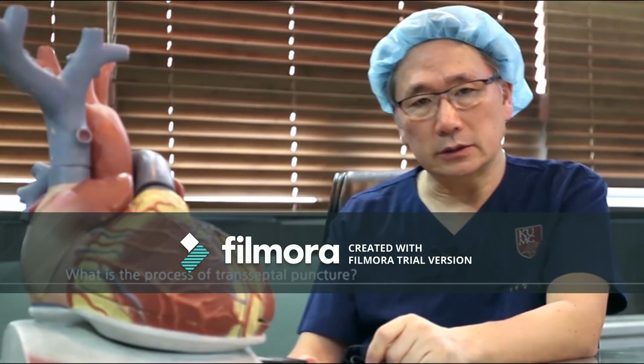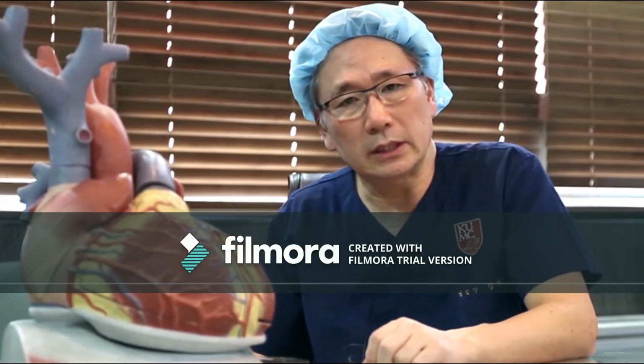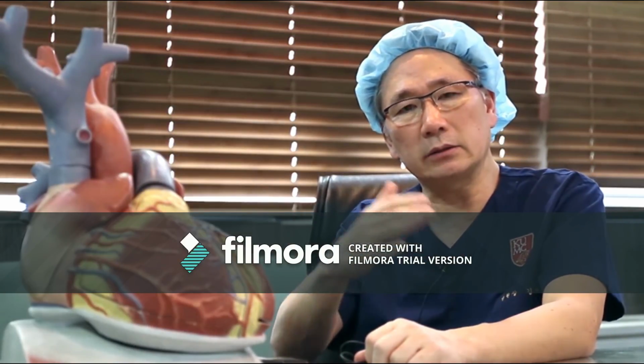Basically our transseptal puncture technique is fluoroscopy only, without any other imaging. On the AP view, we insert the guide wire into the left brachiocephalic vein, and then follow with the sheath, and then exchange the Brockenbrough needle into the dilator and the sheath. After that, we inject saline to prevent any clot or clogging. Then drag down.